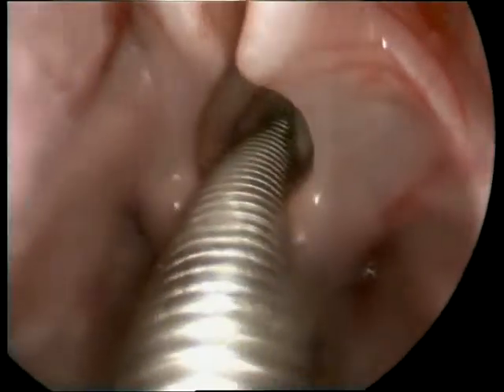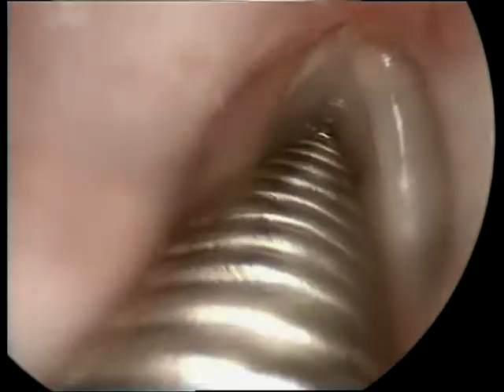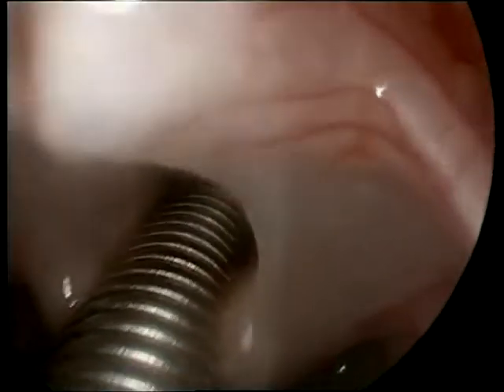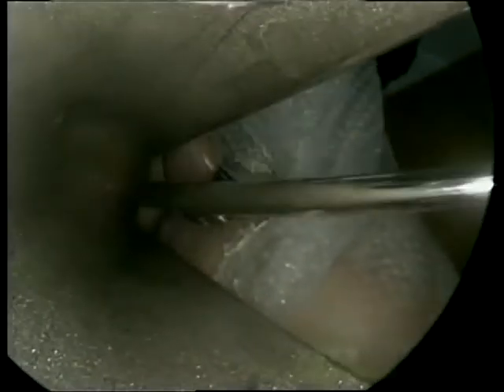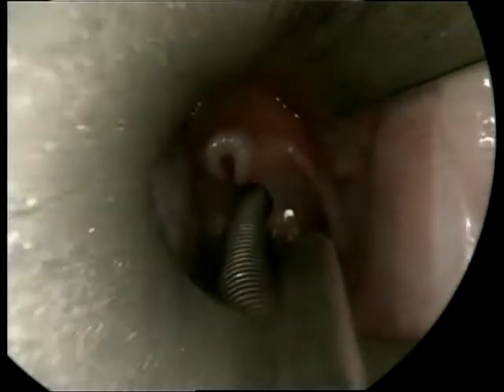As it is clear in these images, you can see the aryepiglottic folds are short, epiglottis is folded, and the arytenoids are tall. Vocal cords are normal and their mobility was checked before the child was put under general anesthesia. Subglottic space and the rest of the trachea and the main bronchi were also inspected and found normal.